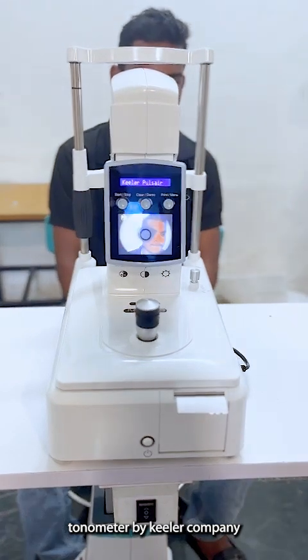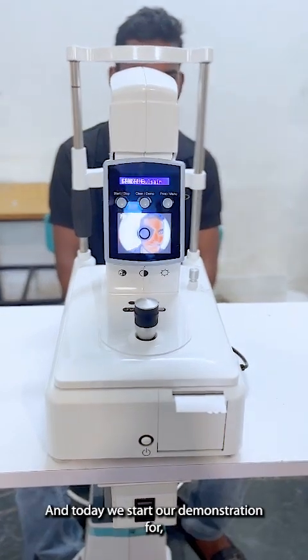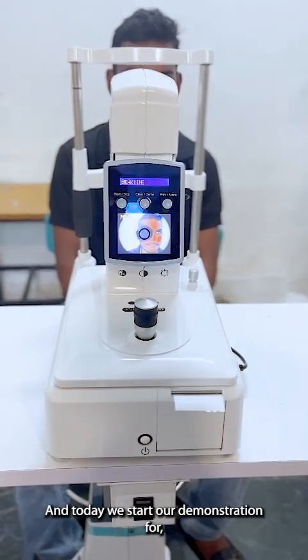This is a non-contact tonometer by Keeler company, and today we will start our demonstration for it.